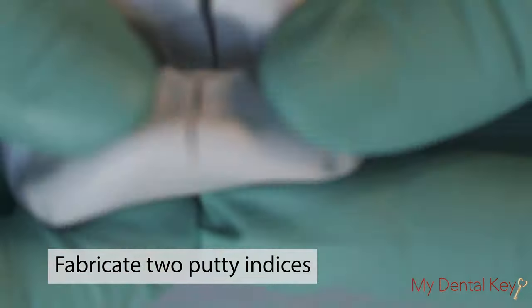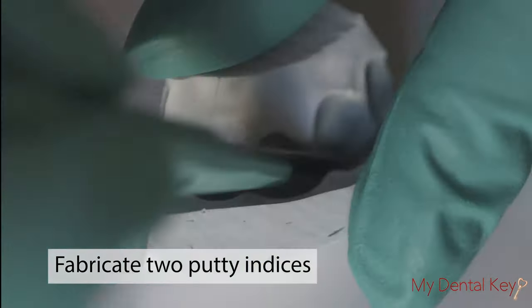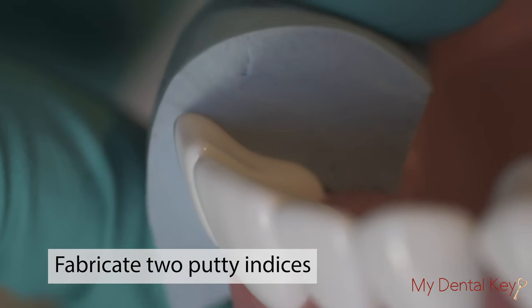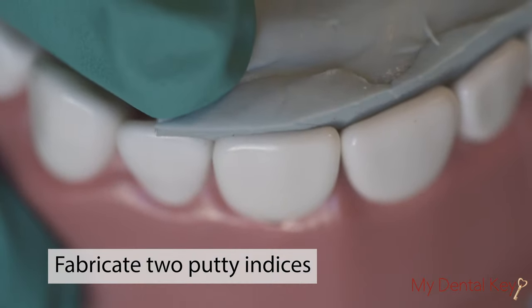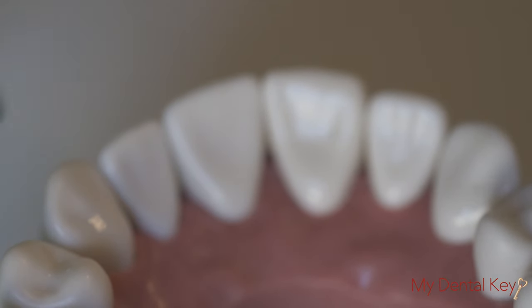Remove the putty and section the indices to create a facial lingual reduction guide as well as an incisocervical reduction guide. Place the indices on the teeth to check their fit. Now that we've prepared, we're ready to begin the crown reduction.